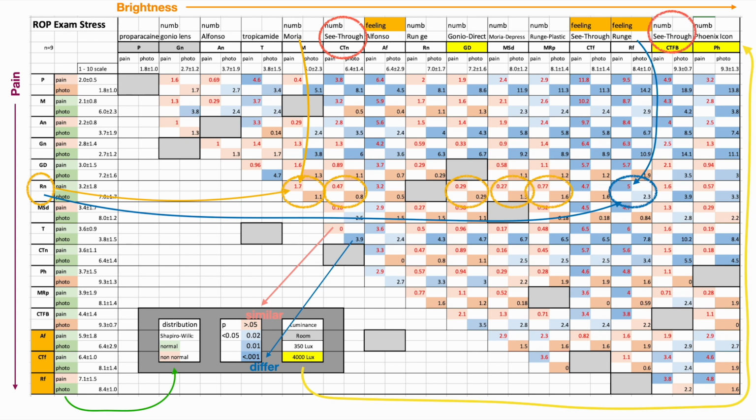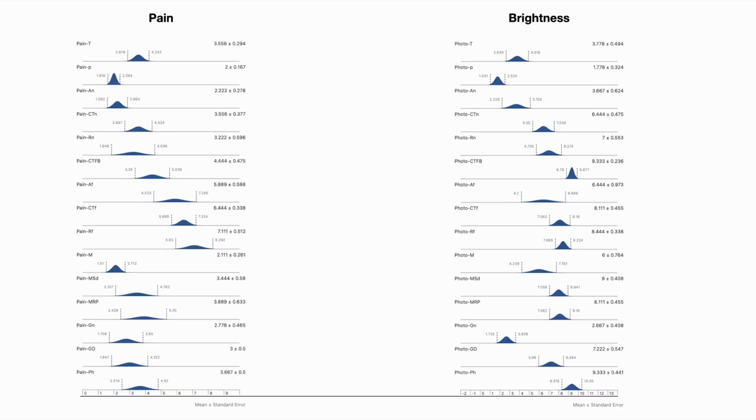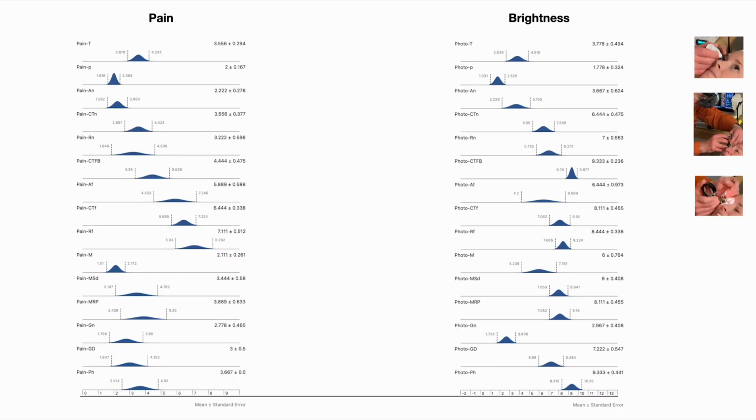We did notice that when we used full bright, we got an increased measure in brightness with see-through scleral depressor, but the Alfonso with similar light increased its brightness when we did not have topical anesthesia. That was also true for the see-through scleral depressor and the Runge scleral depressor. In a similar manner, see-through scleral depression seemed to have more pain with full brightness. We can look at box plots comparing all measures with pain and brightness, but since they're normally distributed, we can measure them using t-tests like this.